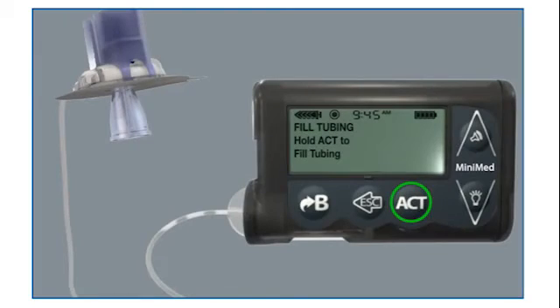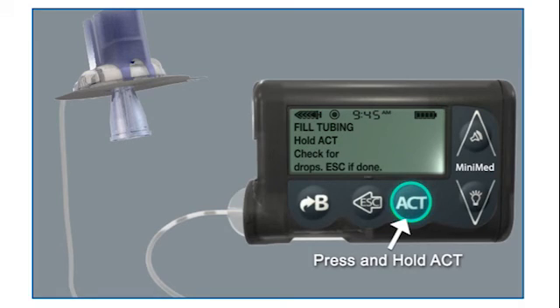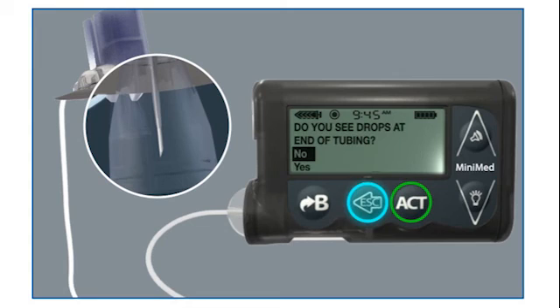Hold the infusion set so that the needle is pointing down. Press and hold ACT to move the piston forward. You will hear a series of beeps as the piston moves forward. Continue to hold ACT until you see insulin drops coming out at the end of the tubing. Press ESC when you see drops coming from the end of the needle.